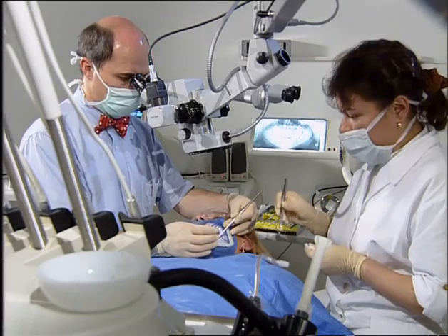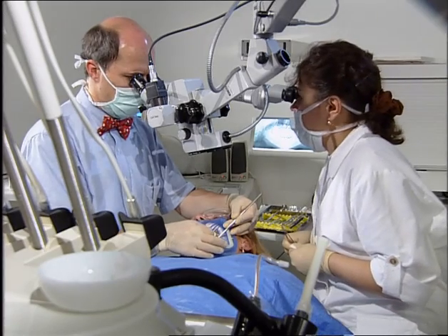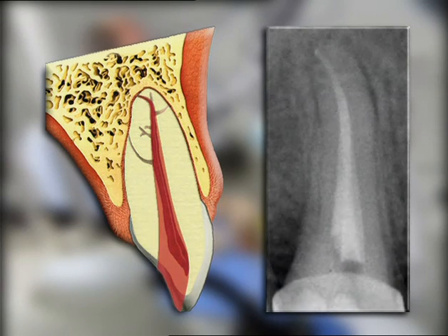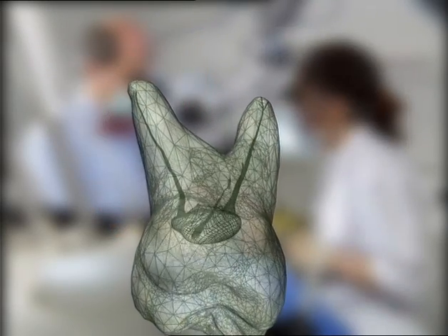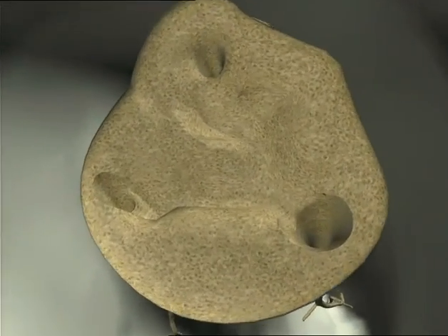Herbert Schilder taught endodontists to think in the third dimension. His five mechanical objectives for successful cleaning and shaping were first introduced in 1974. A continuously tapering conical form is developed with the narrowest cross-section diameter at its terminus. The root canal preparation should occupy as many planes as are presented by the root canal system, that is, multiple planes. This objective preserves the natural curve or flow.